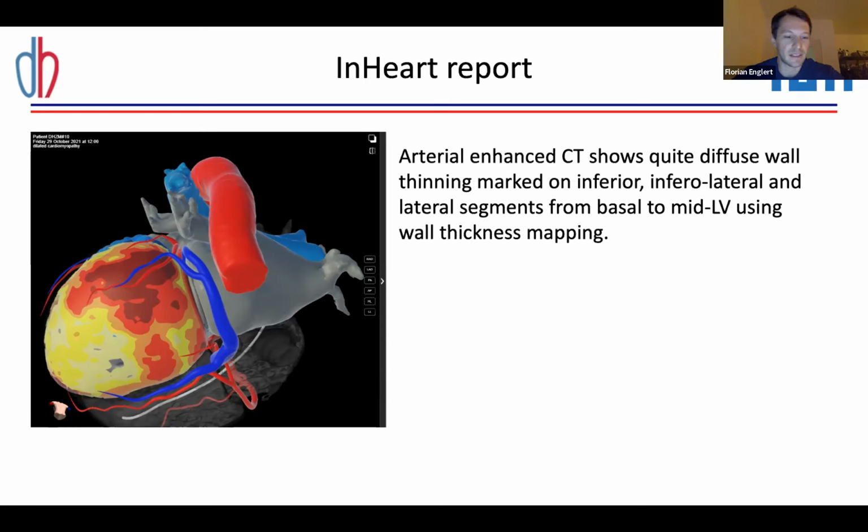The patient had the last catheter ablation a few months ago, I think. So there was nothing there, and because of the last ablation, where we did a substrate modification in a huge area on the LV without a really good target, we just decided to do a new approach and maybe get a good idea what to target.